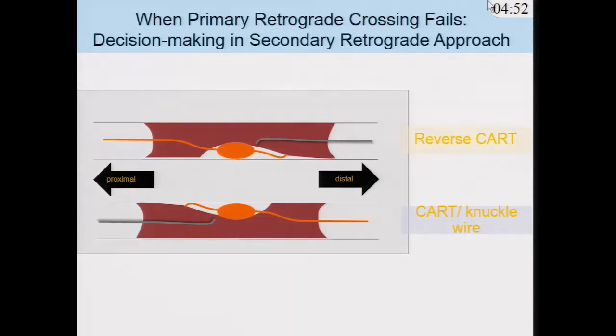And currently we use the reverse CART technique. In the past we used CART technique, but we are not using it any longer. The reverse CART is much, much easier because you can control your retrograde wire in the small cap, and then your antegrade wire forward.